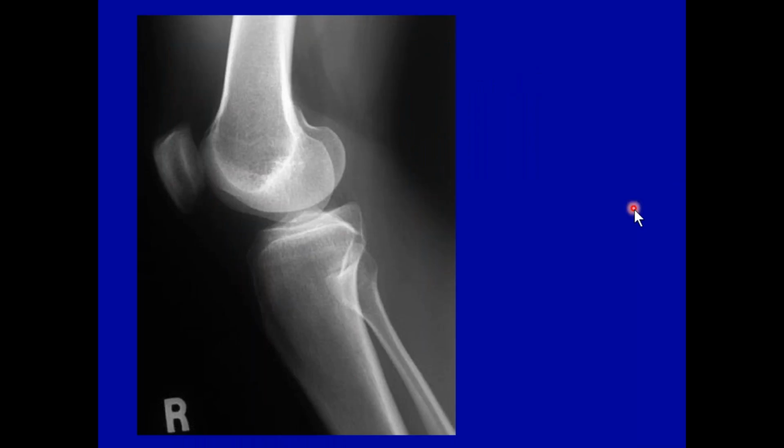That's what a good lateral looks like, and the reason we tilt our tube is, even when the tube is tilted, the edge where the laser pointer now is the epicondyle of the femur, and the medial one is bigger. And because the medial one is bigger, if you don't tilt the tube, you will get superimposition. This is pretty good, but we're trying to get around the anatomic fact that the medial epicondyle is larger.